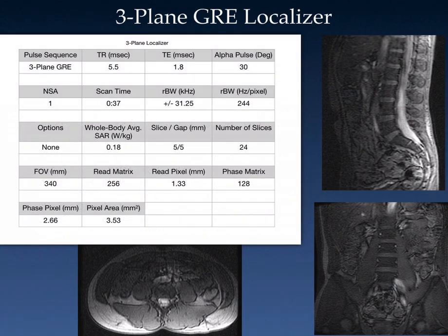Let's start with the three-plane gradient echo localizer — nothing fancy here, just a three-plane gradient echo localizer with right out of the box parameters. Two important factors: the whole body SAR is extremely low at 0.18 watts per kilogram, and the scan time was just 37 seconds.